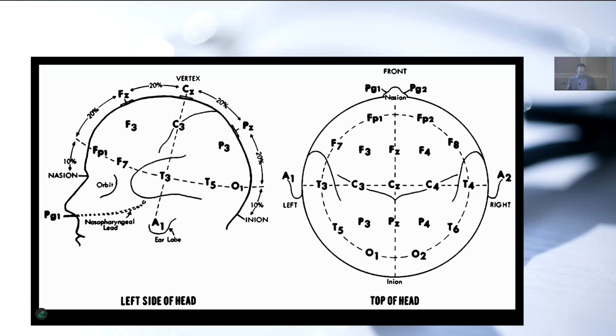So really quickly, EEG is a bit like an EKG in the sense that we place electrodes all over the head. If you want to be thorough, you'll place electrodes at all of these points that you see listed in the standard 10-20 montage. For convenience in cardiac anesthesia, we very often will put them only in the front, just because we have a piece of scalp that doesn't have hair and is available to us, whereas the back is kind of sitting against the surgical table. For simple convenience, we often will omit essentially all of these. When we do things a bit more seriously in the OR, we will often put the front half.